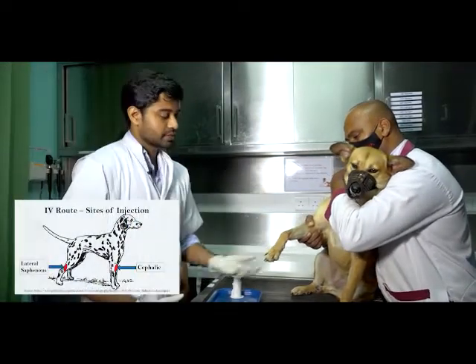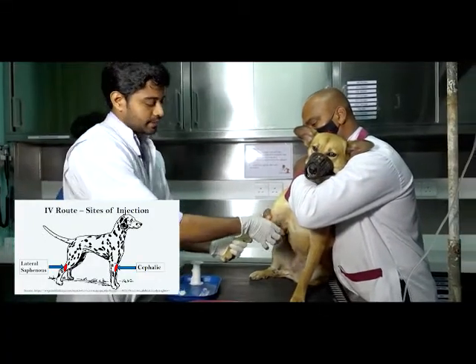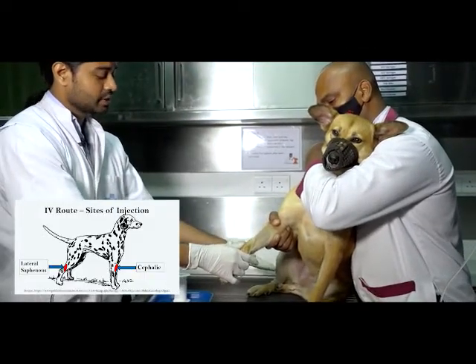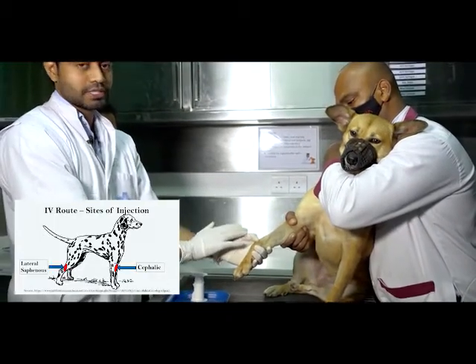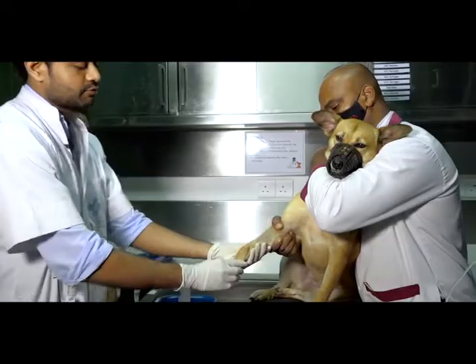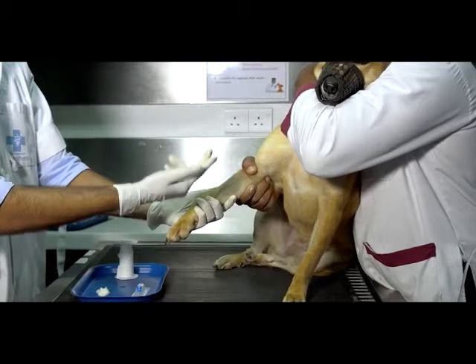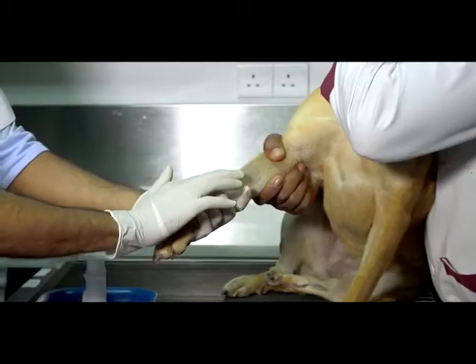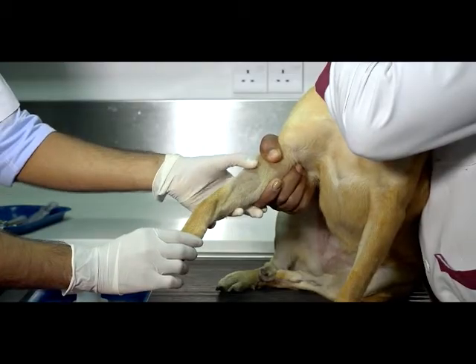Well, just to let you know about the sites where you could place an IV catheter, we have the cephalic vein that runs along this radial ulnar position in the forearm, and also it could be given to the lateral saphenous, which is at the hindquarters. But today we are going to place an IV catheter to Harmina at the cephalic vein, and for that we will have to first shave or clip it. For that you can use a curved pair of scissors, or you could even use an electric hair clipper. So we've clipped this site with an electric hair clipper, and Harmina is ready for her IV catheter.